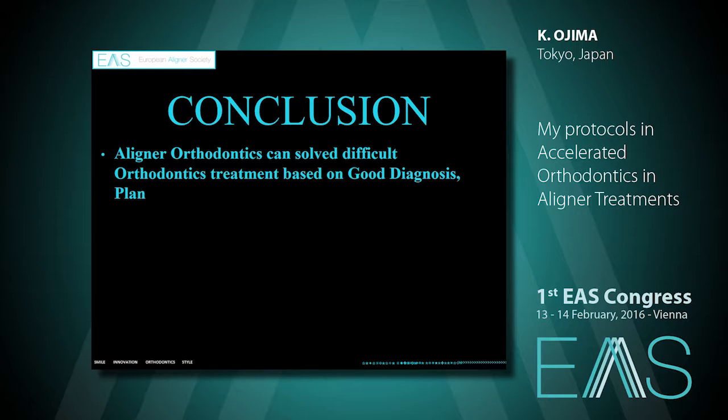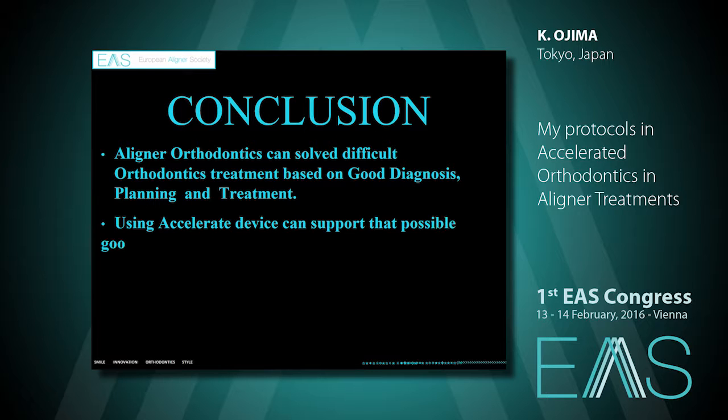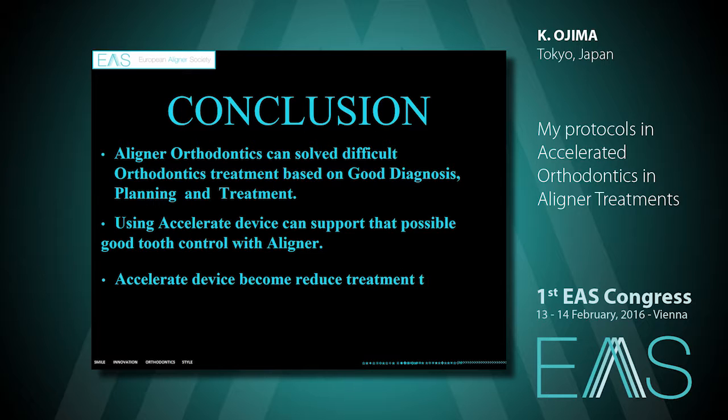The conclusion: aligner orthodontics can solve difficult orthodontic treatment based on good diagnosis, planning, and treatment. Using an accelerating device can support good tooth control with aligners. The accelerating device reduces treatment time and pain.